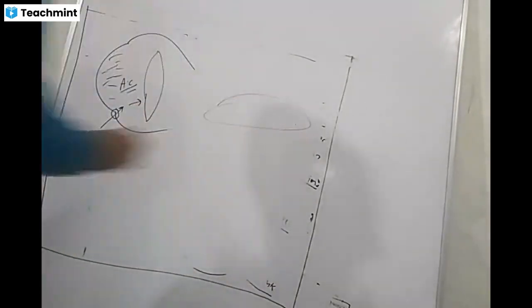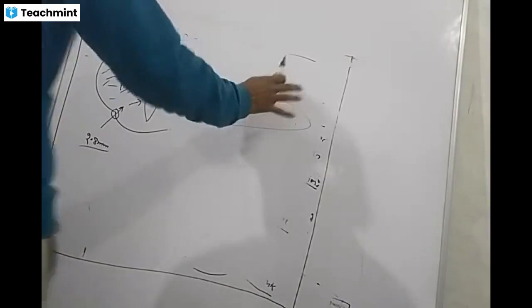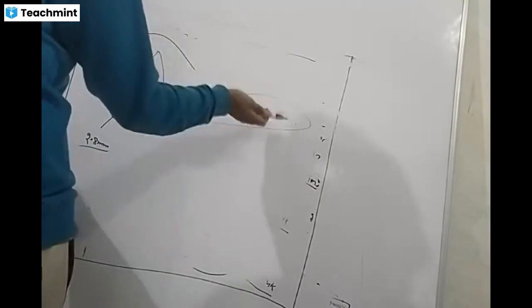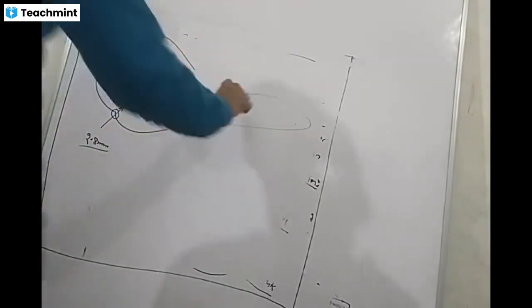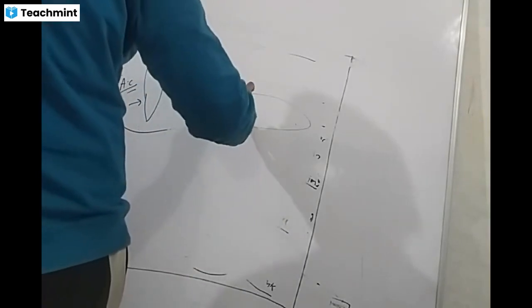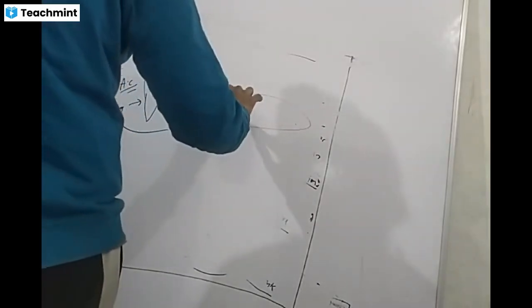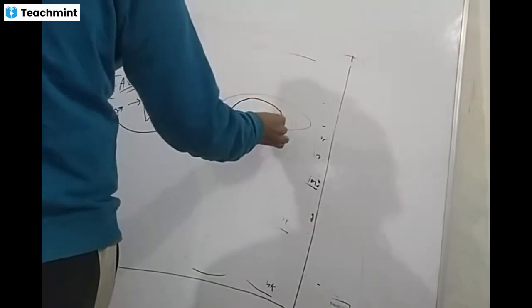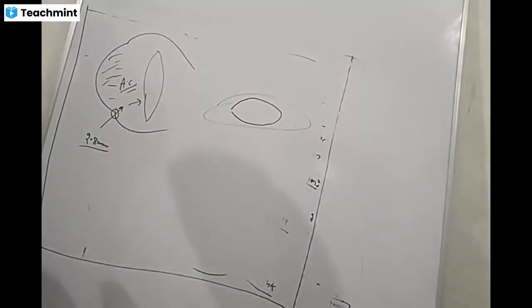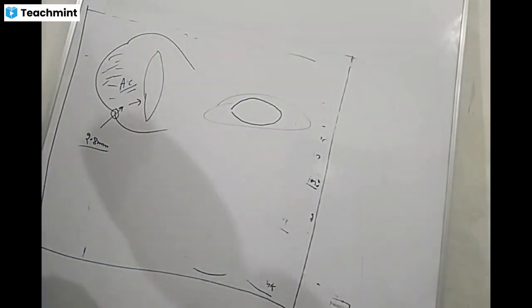This is the lens. If you look from the dorsal surface, you will see it in three dimensions. If you see from the dorsal surface, you will see the anterior capsule, because behind this is the posterior. So continuous means once you keep your instrument, don't remove it in between. Start like this in a circular manner and cut like this. This is continuous curvilinear fashion.